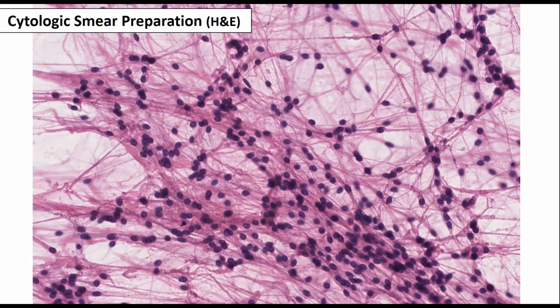What about the nuclei? We also do smears to look at nuclei that are not distorted, not altered. And what should be striking you about these nuclei is their uniformity. They are magnificently uniform, oval, really. They're not quite round enough to be oligo, and it's not oligo anyway because there's too much.